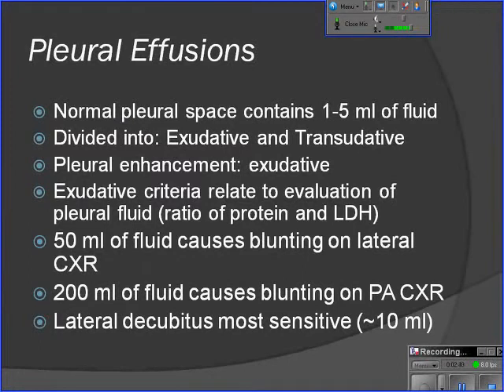Exudative effusions tend to actually show pleural enhancement. They don't have to all the time, but they usually do. There are various criteria for exudative effusions based on analysis of the pleural fluid. I won't go into them, but they relate to the amount of protein within the pleural fluid versus the serum, as well as LDH levels.